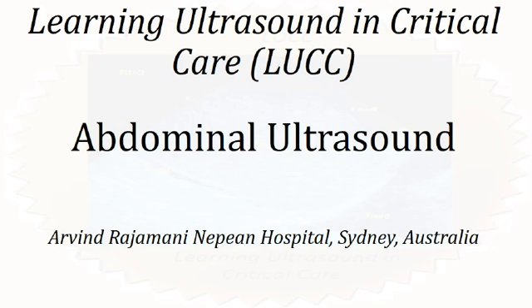This module is going to talk about abdominal ultrasound. And remember once again that we are talking of point of care ultrasound done at the bedside by a non-radiologist, which means that we'll be mainly talking about clinically relevant focused ultrasound. My name is Arvind Rajamani and I work in Sydney at the Nepean Hospital.